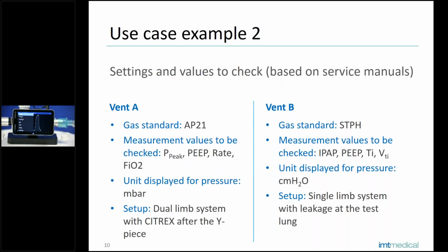As my ventilator B is using centimeters of water to display the pressure, I will also select it here on my CITREX H5.